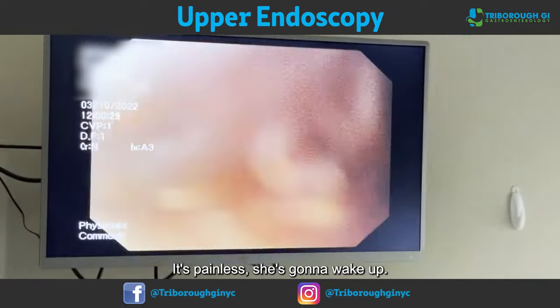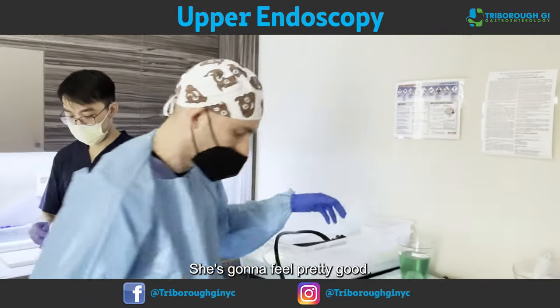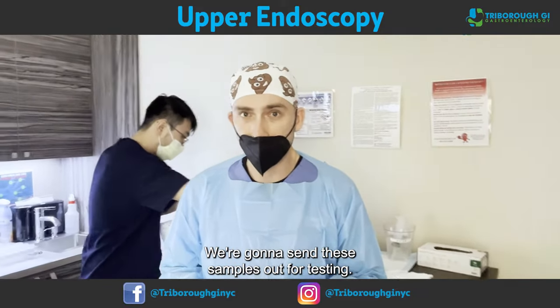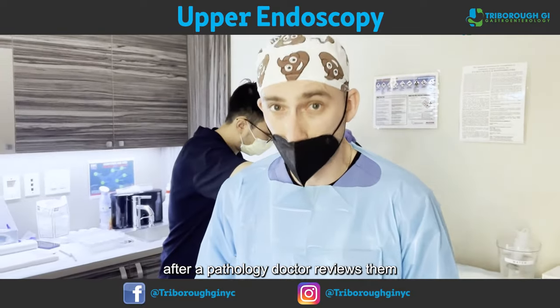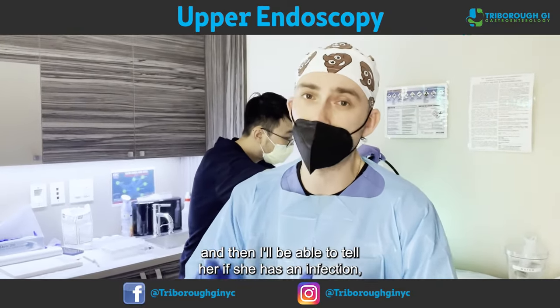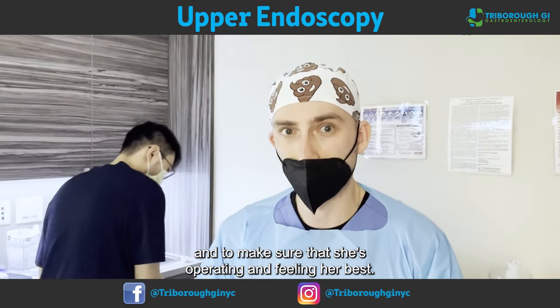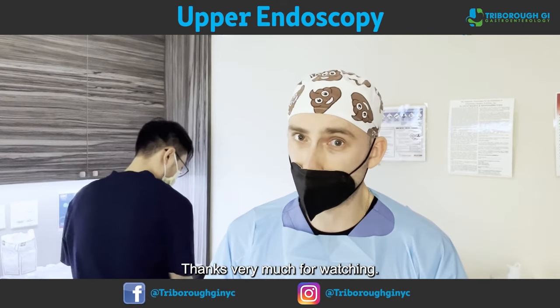It's very quick, it's painless. She's going to wake up and not feel anything — she's going to feel pretty good. We'll have a lot of information. We're going to send these samples out for testing; the results will be back after a pathology doctor reviews them. Then I'll be able to tell her if she has an infection or celiac disease, and help her with her symptoms. Thanks very much for watching.